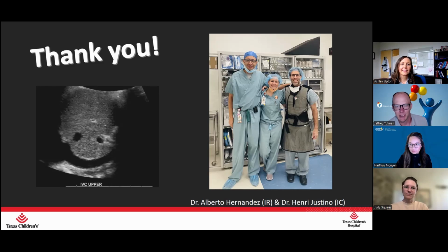So if you have that normal value, what do you use? Are you using patients as their individual controls and tracking it over time, or are you using that in reference to those cutoff values in the literature to actually say this is abnormal? How are you using those numbers?